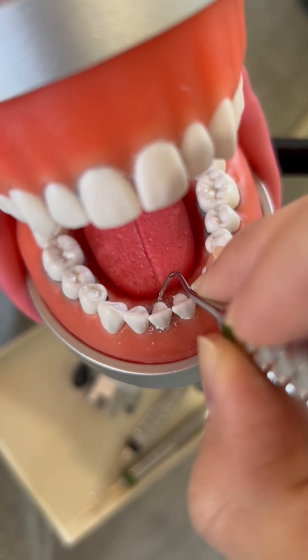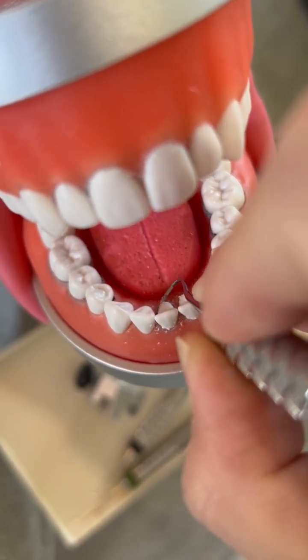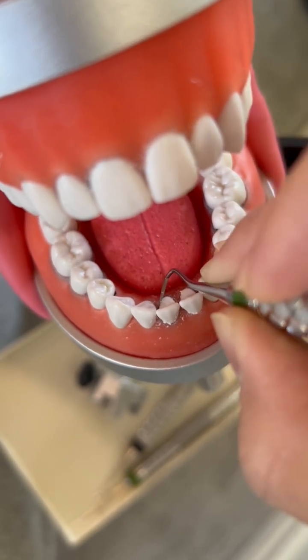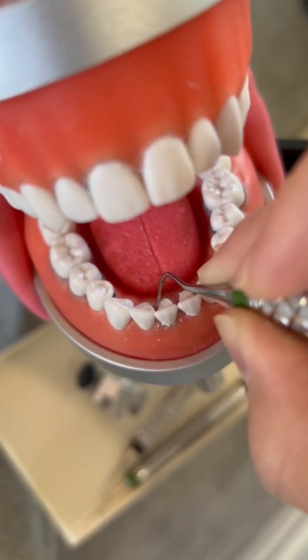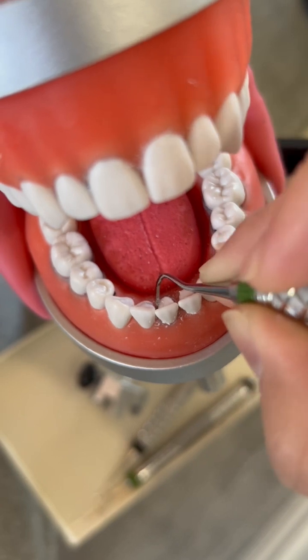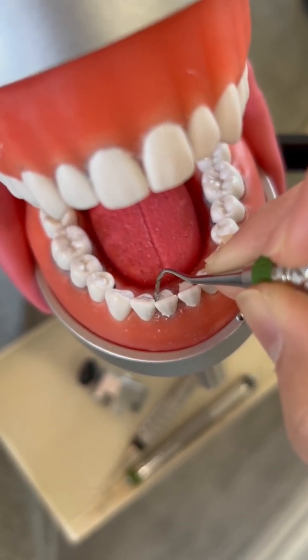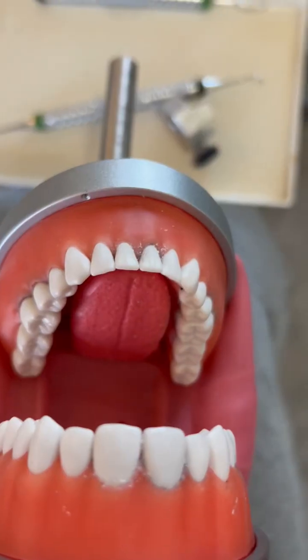Same with tool number 25. Start at the midline, side to side, pivot and roll, side to side, pivot and roll. Only go half of the interproximal space. Surfaces away.